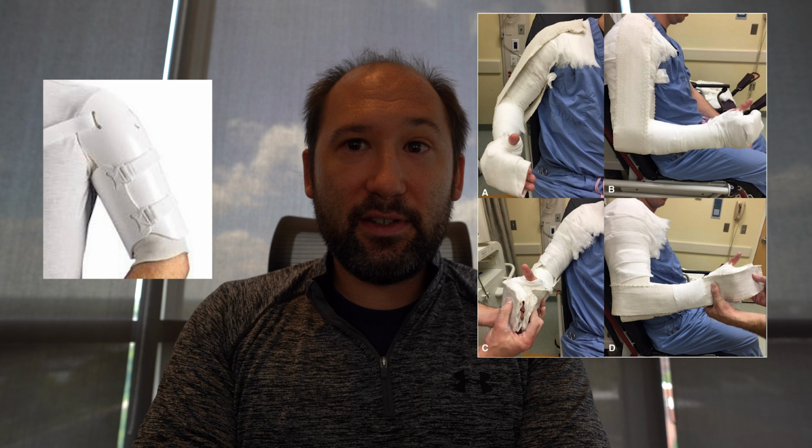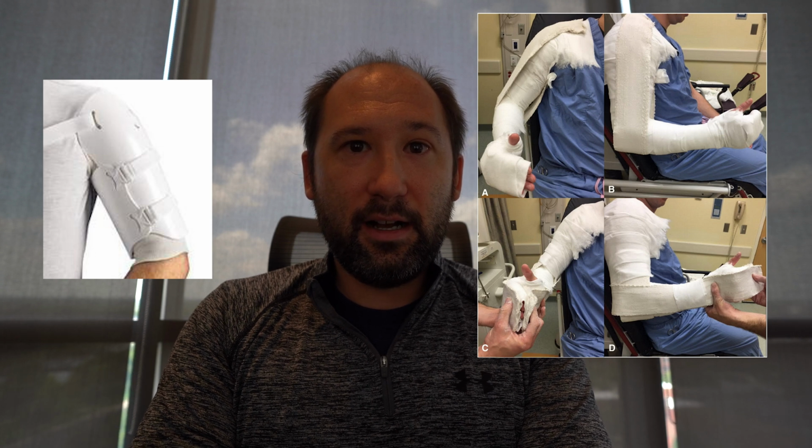For our poll questions this week, I have 5 questions that I will post on Twitter with hashtag FXConf, hashtag fracture conference. I'm curious to hear what everyone does for initial immobilization of a humerus fracture. Do you guys use a Sarmiento brace right away, or do you put patients in coaptation splints? I'll include a picture of a coaptation splint on the screen here.